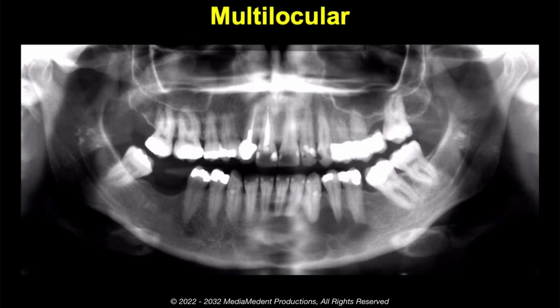A 25-year-old Caucasian male with an extensive dental history presented for dental care. His chief complaint was a painless swelling located in the mandibular anterior. He was unable to say how long this swelling had been present. He reported no history of trauma. On clinical examination, the area was found to be tender, and the overlying mucosa appeared slightly purple in color.